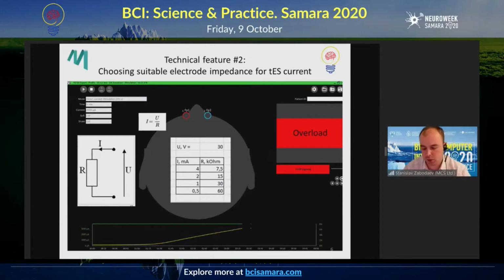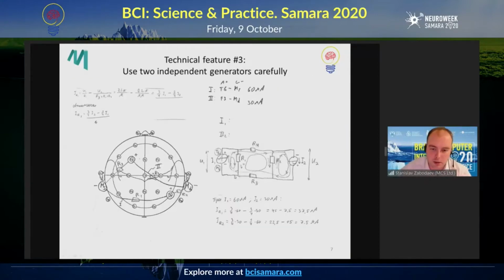And that is something that we've seen in a clinical setting. But if we're talking about research, of course, we need to ensure reproducibility. If the research specifies 2 milliamperes, then each subject should receive 2 milliamperes. So that wouldn't be acceptable. Let me apologize for this slide. It is hand-drawn. I didn't have enough time to make it prettier.